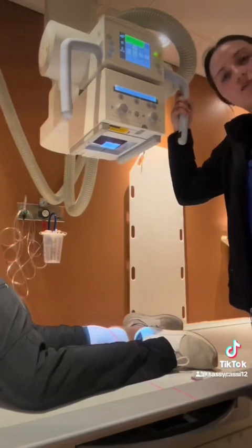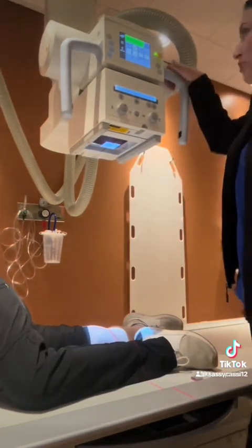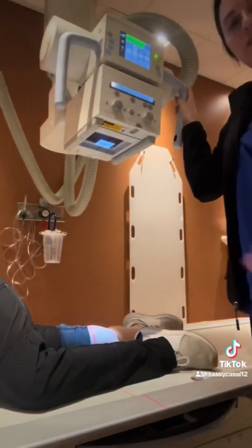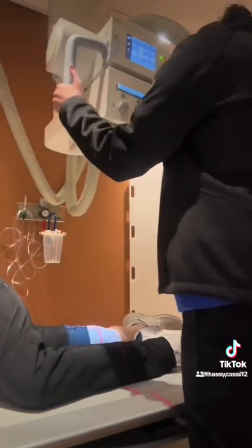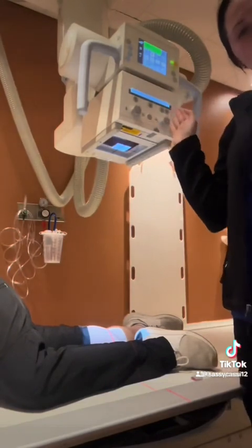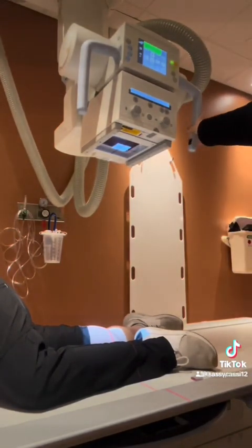And then for a lateral knee x-ray, we have to angle the tube cephalic 5 to 7 degrees to show the joint space. And since I did that, I now have to realign the bucky and the tube. So now that the bucky and the tube are lined up after putting the angle, I will then move the table to put her in the correct position.